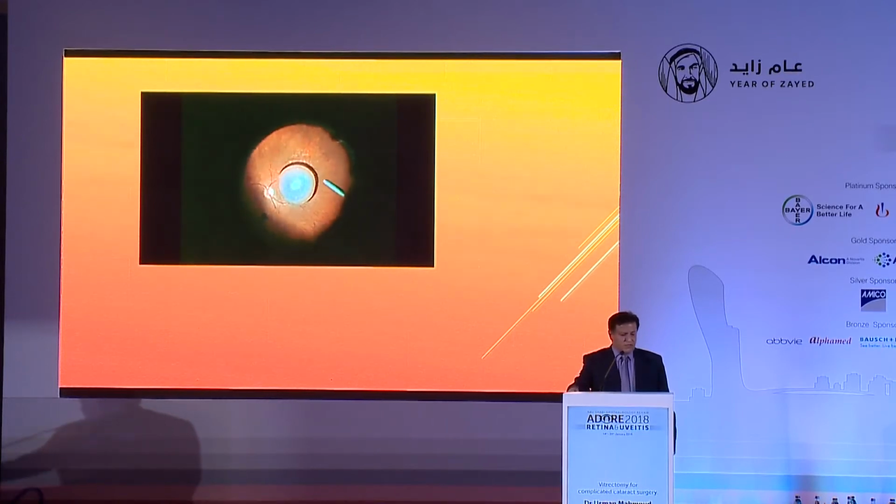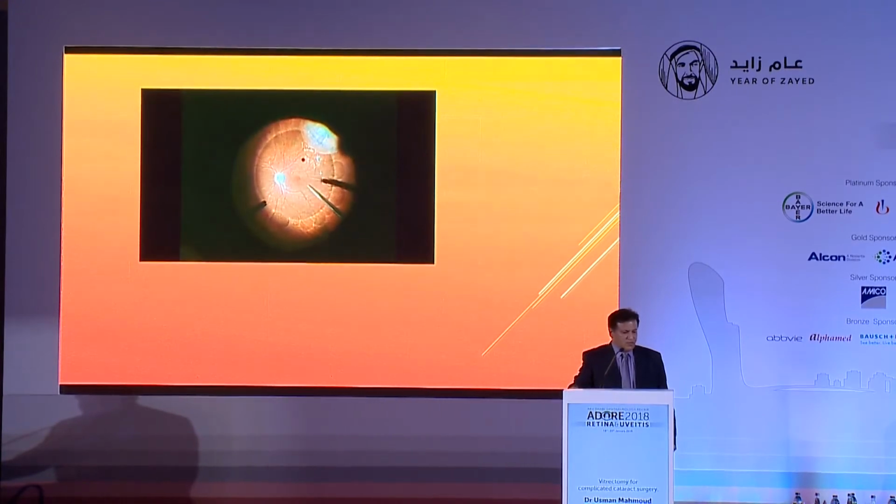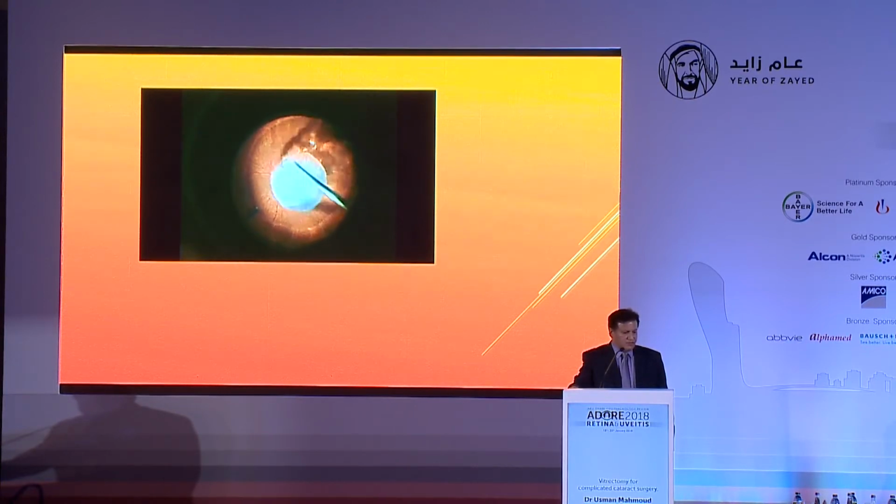Shaving, I think, is important, especially in some cases where there is some vitreous hemorrhage, and I normally employ retroillumination to go to the vitreous base and completely remove it. And once the shaving is done, I always then proceed to the posterior pole cushion with the heavy liquid, and then removal of the nuclear fragment. 23 gauge in my hand, I think, is pretty efficient. And normally I grab it with the edge and then start the vitrectomy.